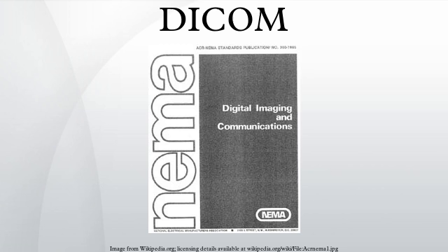Query retrieve. This enables a workstation to find lists of images or other such objects and then retrieve them from a picture archiving and communication system. Modality worklist. This enables a piece of imaging equipment to obtain details of patients and scheduled examinations electronically, avoiding the need to type such information multiple times.